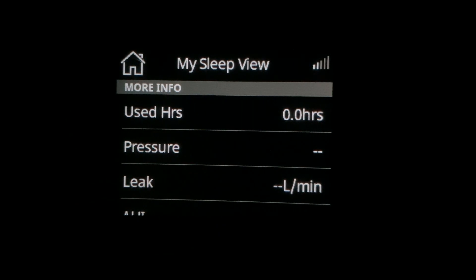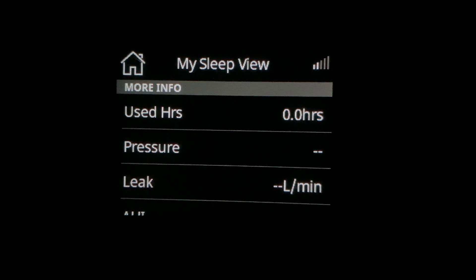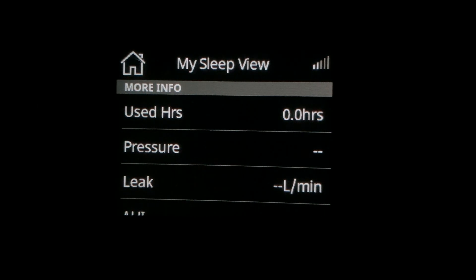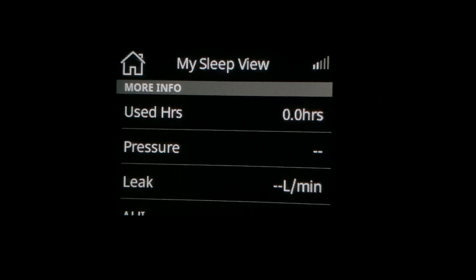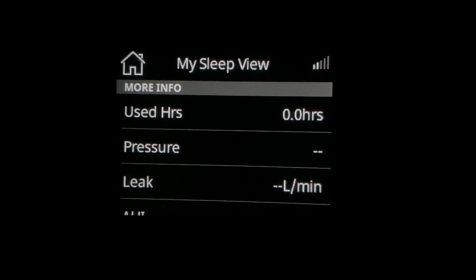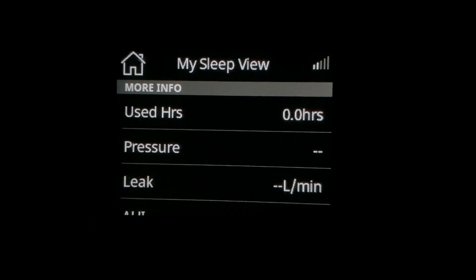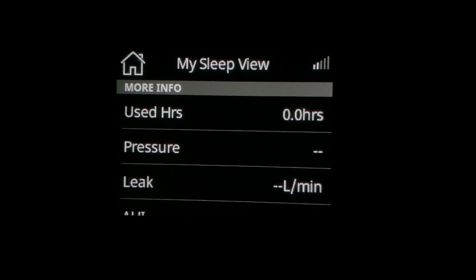On leak, what you would do is look at the number. The goal is to try to get the number below 24 for most people. It may be difficult to get below 24 if you have higher pressure, or if you're a mouth breather and you are not able to get your mouth closed through strategies such as using a chin strap and higher humidity.